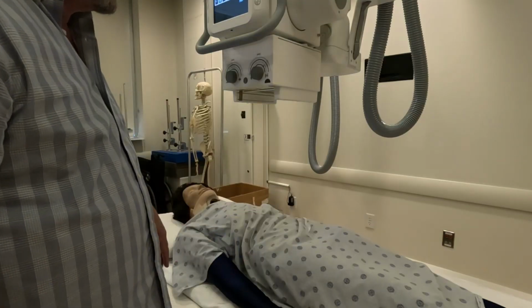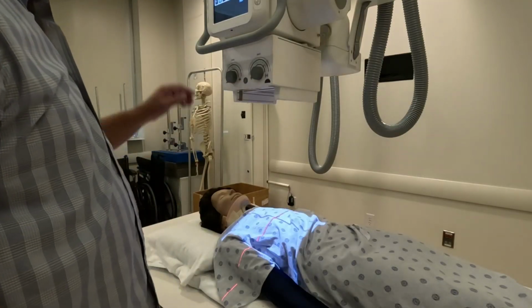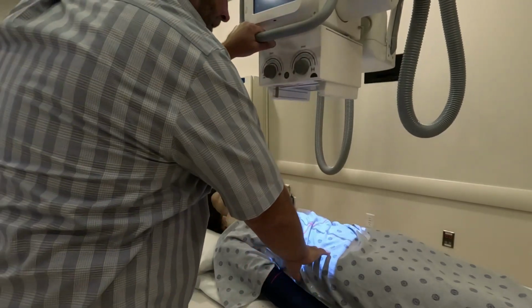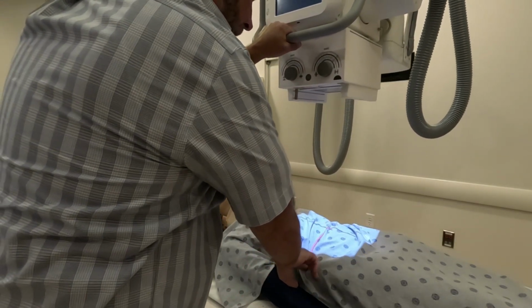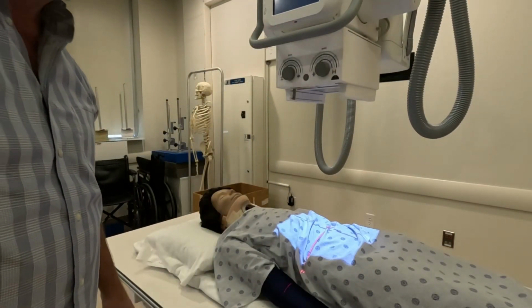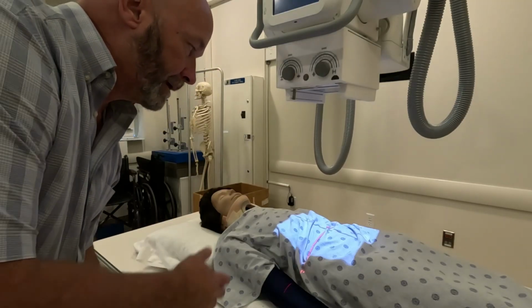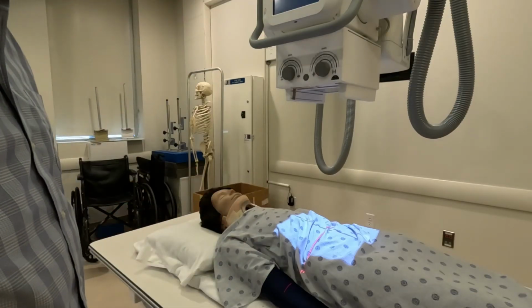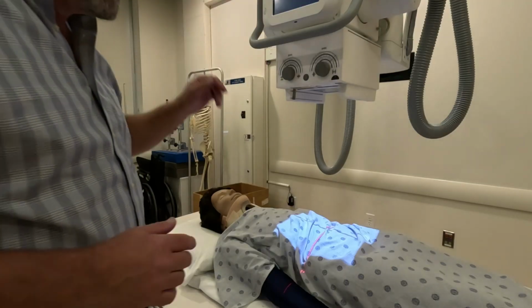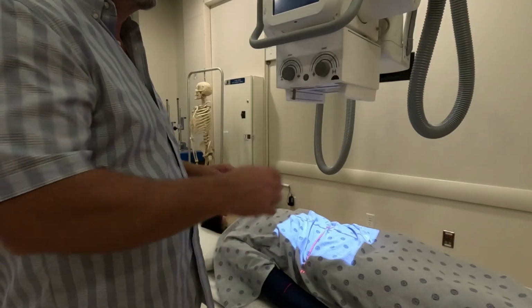What you're going to have a tendency to do, if the patient is, let's say, here on the table, is take the X-ray tube and move it. You're going to align it like that. And then you might or might not forget to move the image receptor to correspond to the light field. And whether you do or not, you're still off because you're not locked in. Okay? So again, I know I'm beating this to death, but this is what you're going to have a tendency to mess up the most early on.